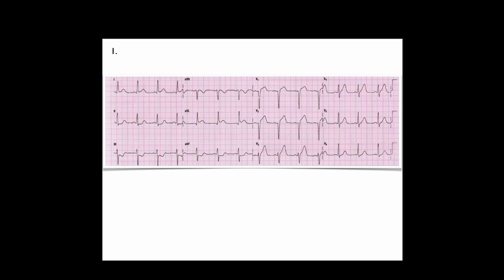I see depression. A tiny bit in 2, 3, aVF, and then I see elevation in aVL.